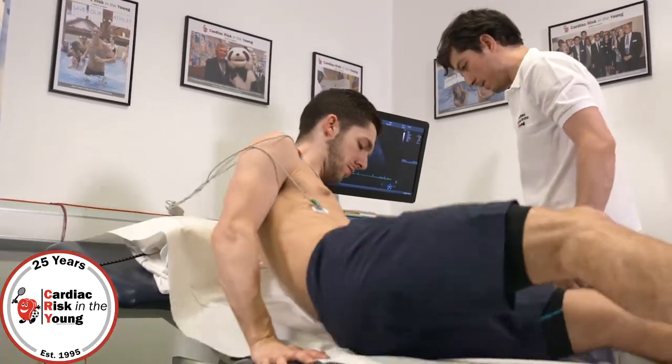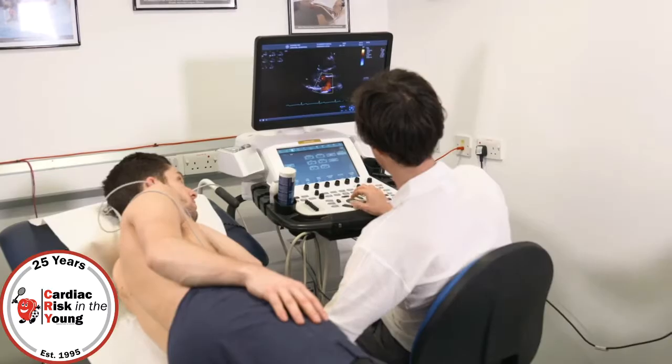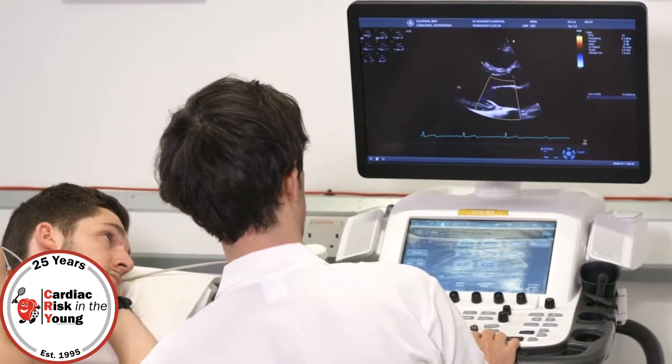Roll on your left side, right over, that's it — a little bit of cold jelly on the chest. The red and blue shows us the movement of your blood through the valves.